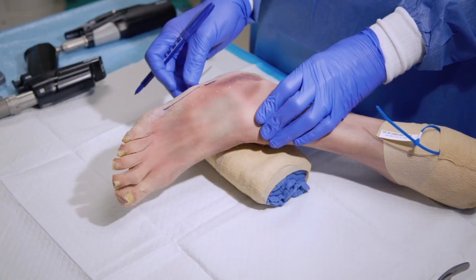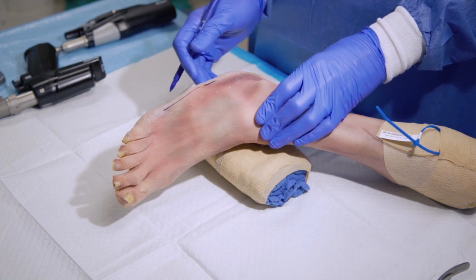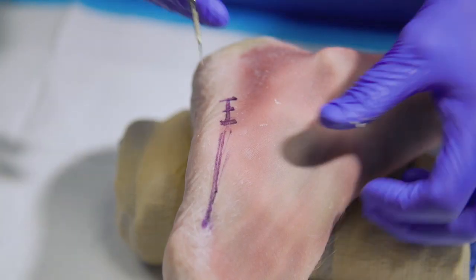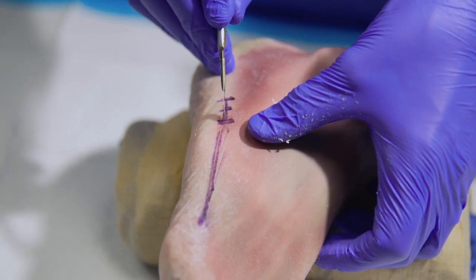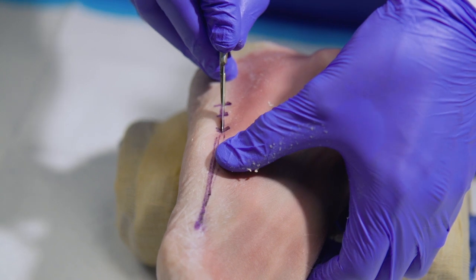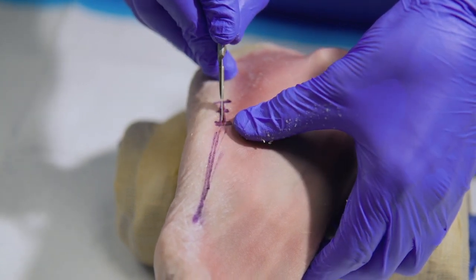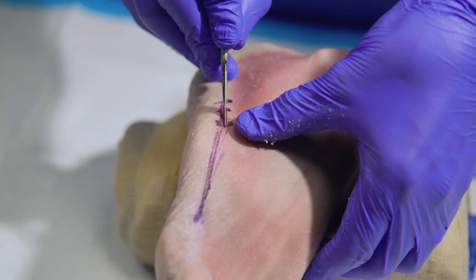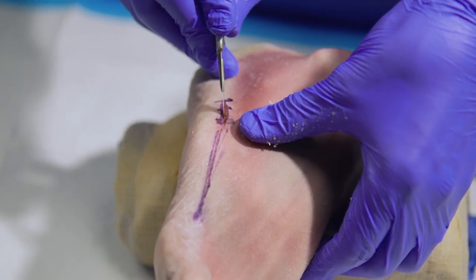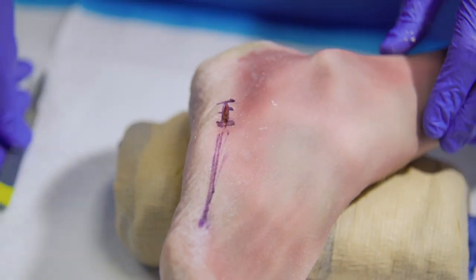You also have to be mindful of the location of the sural nerve and peroneus brevis tendon during dissection. So now we've lined up the incision point about one and a half to two centimeters proximal to the fifth metatarsal base. Controlled dissection, again being mindful of the peroneus brevis tendon and the sural nerve.